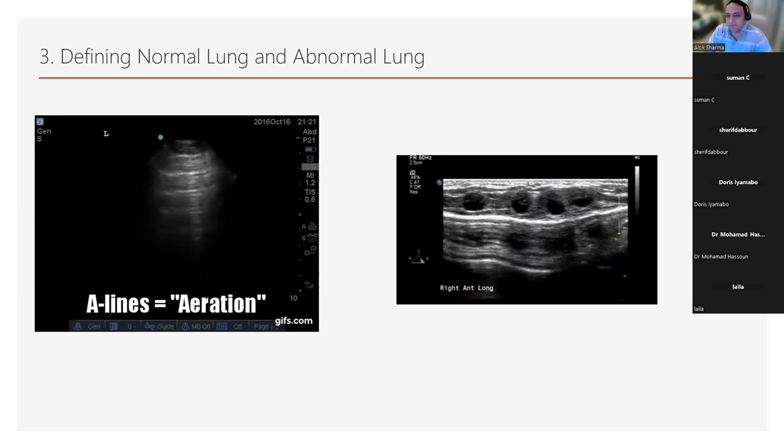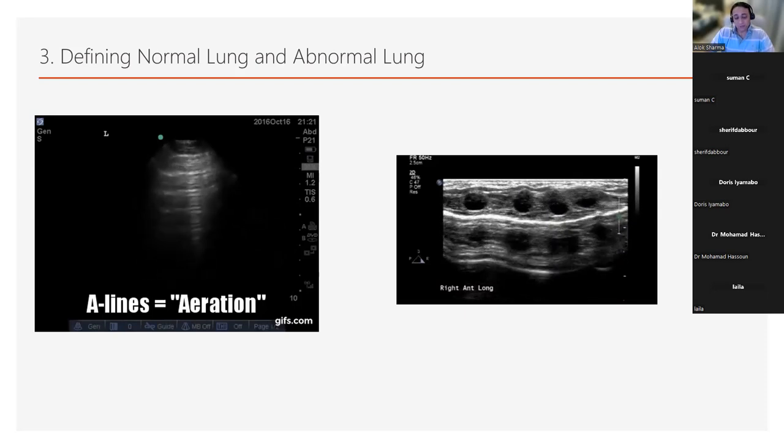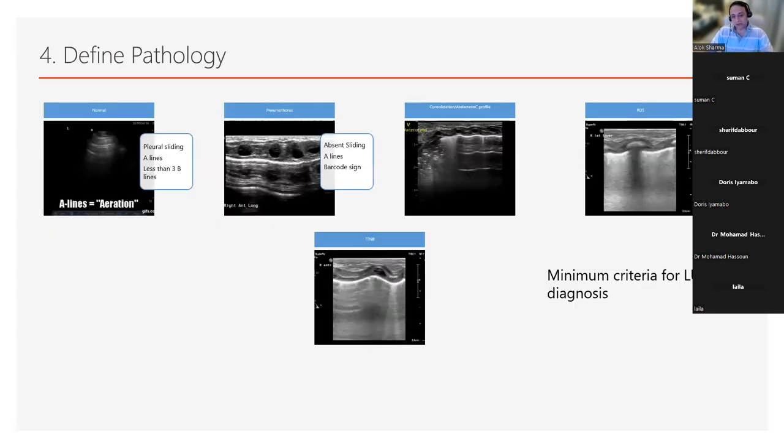So really, the reason I want you to do this is because you need to define amongst yourselves as a group how you define that. You might have clinicians who are doing PICU and NICU. You might be working on a unit which has a significant overlap, but you might have babies who are 30 days old versus newborn babies coming back to your unit, inborn and outborn babies. And then you have to define what abnormal is. A simple example is defining every pathology that you want to diagnose as part of your guideline.